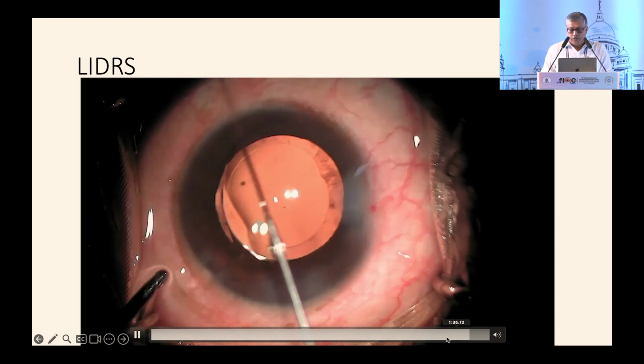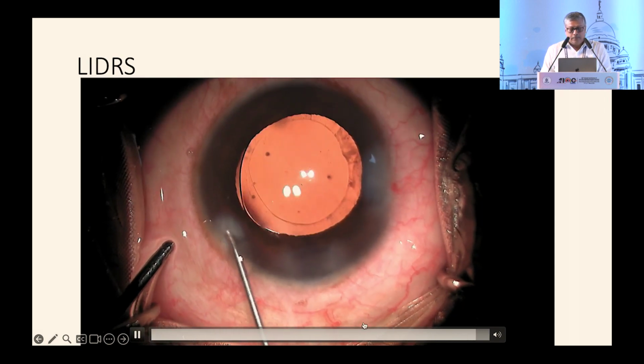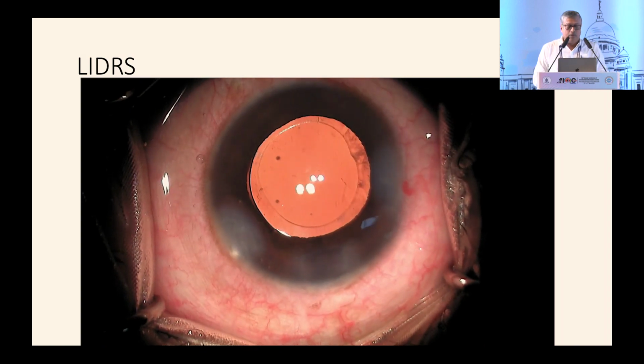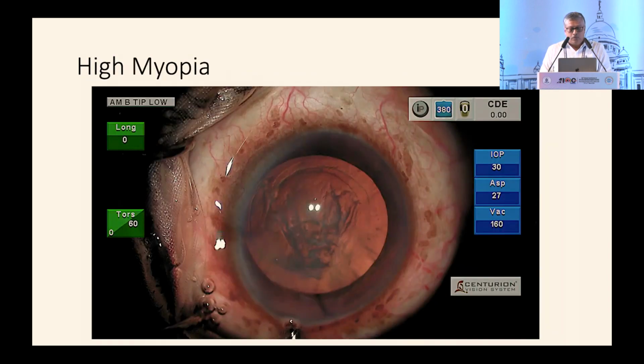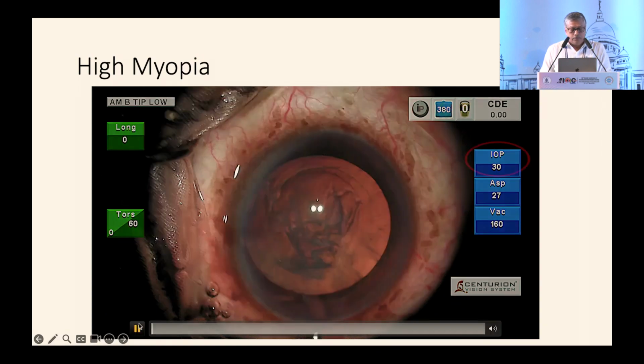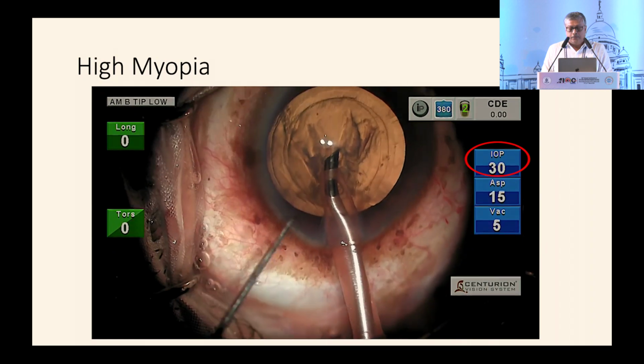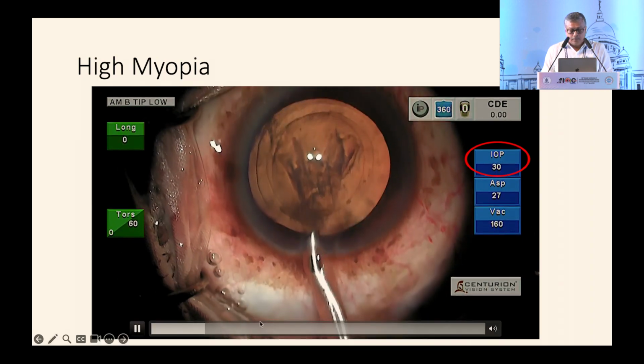So you have to keep your irrigation on while hydrating the wound so as not to allow the anterior chamber to collapse.